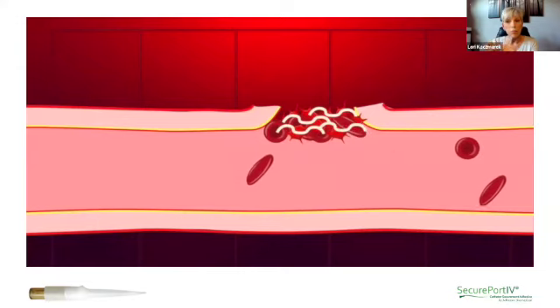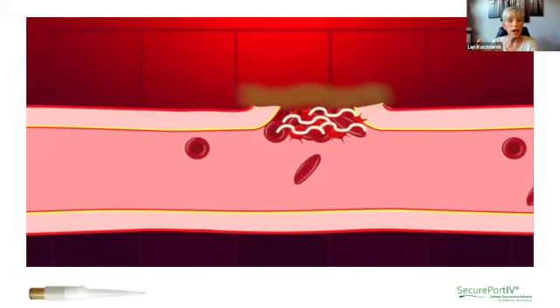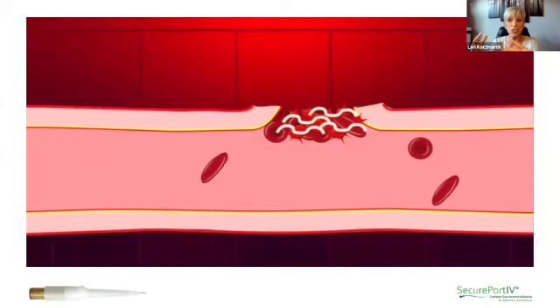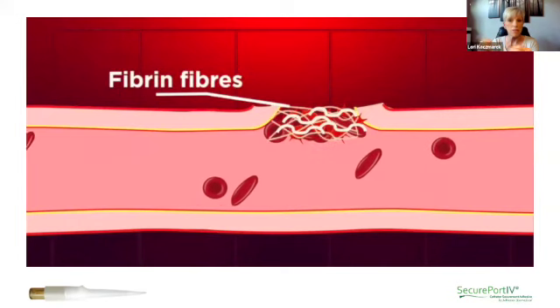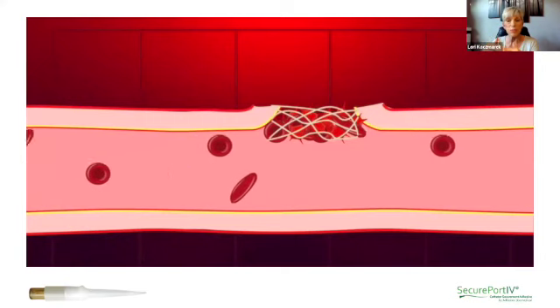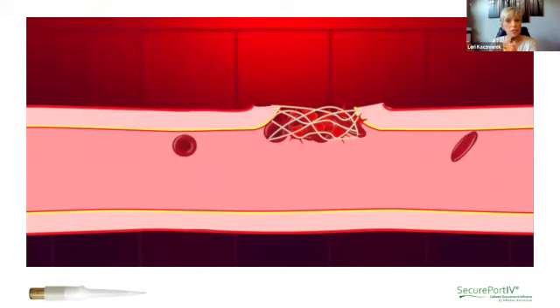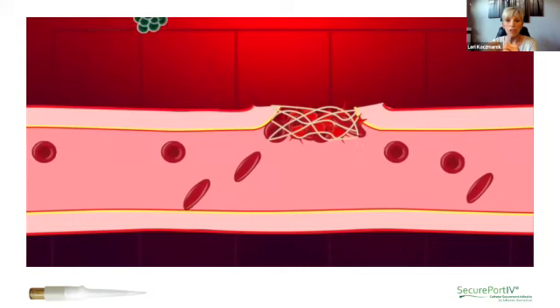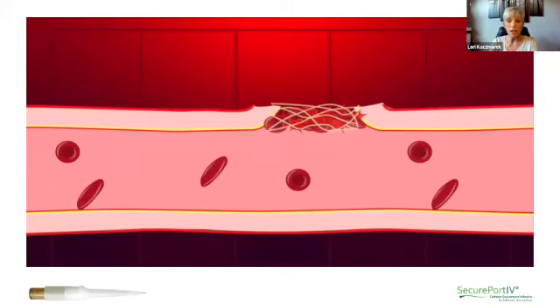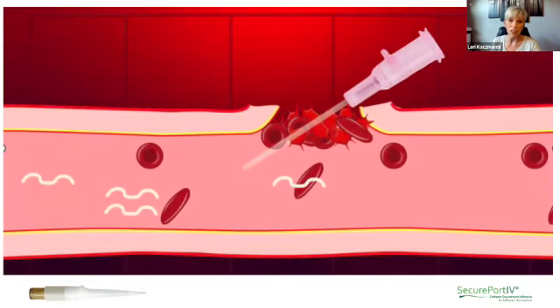Now, what's probably quite unique in the image that you're seeing is that there's no catheter there. So with all the functions working correctly, there will eventually be this fibrin matrix that aggregates around and wraps and forms the scab that is then responsible for helping protect us from pathogens again. So I see a lot of this hospital onset bacteremia and the discussion about our catheters getting infected tying in well to this discussion about post-insertion bleeding and oozing, because we really need to take a closer look now. What happens when we put that IV catheter in there?